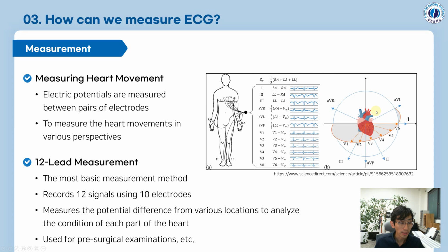To measure electric potential, it's the same for ECG and EEG and EMG and EOG. It's all the same: we need at least 2 electrodes. One is the baseline and the other is where we want to measure. So we can measure the electric potential between the 2 spots. Otherwise, it's very difficult to get the change of the electric charges.